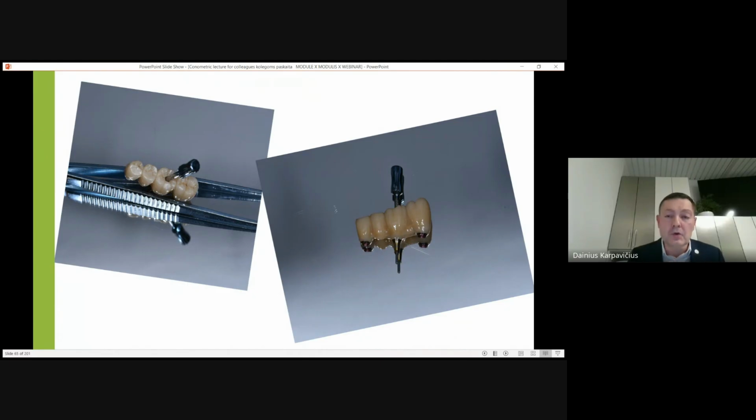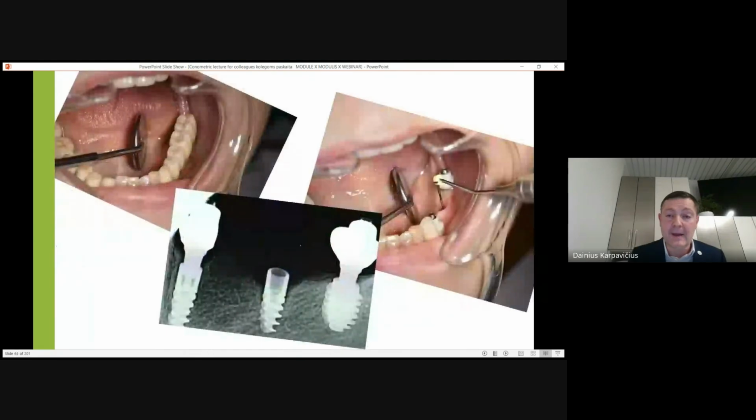So in the middle we used a regular T-base, because with the T-base you can be about maybe half a millimeter deeper, because conometric is a construction that even with the shortest abutment, with the shortest conometric step, you are a bit higher on the level. And if, for example, I had submerged the implant more or didn't have the thin tissues around these years ago, maybe here we could also see conometric, and maybe we wouldn't see the periimplantitis. But for today, we see here that the middle implant has a problem.